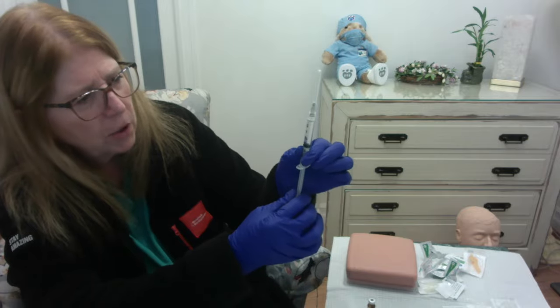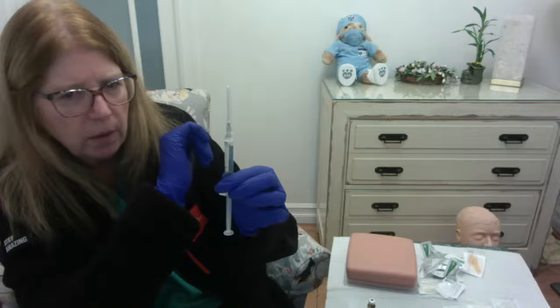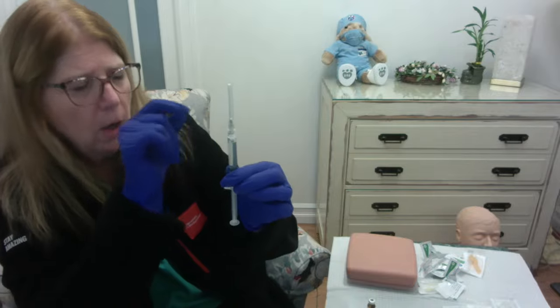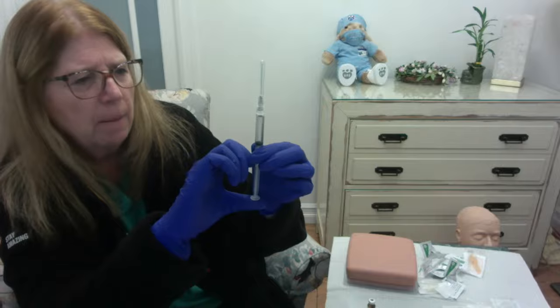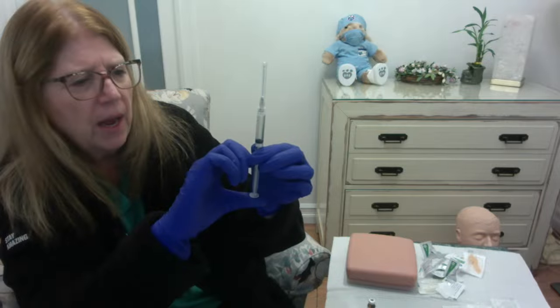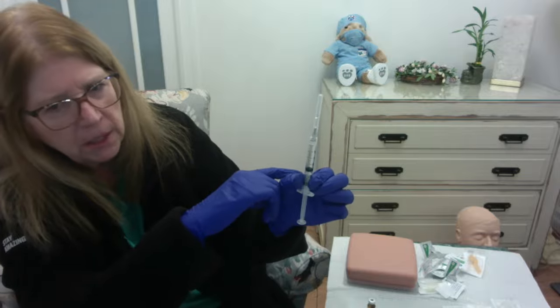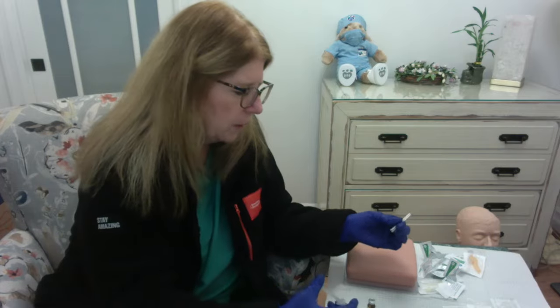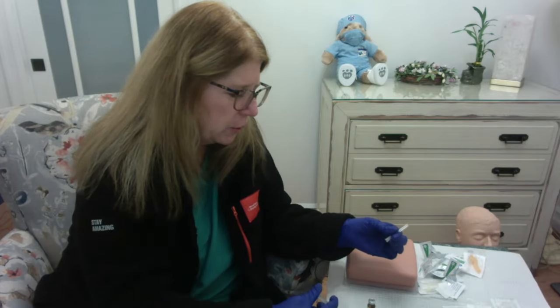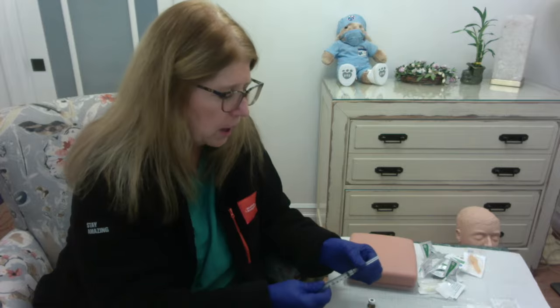So again, I'm going to draw back until I have level fluid. I'm filling it with more air. And then I'm holding this very steady and level, and I'm pushing up that air until I'm at my 2 milliliter mark, okay? All right, so we have our 2 milliliters or 10 milligrams of folic acid, okay?